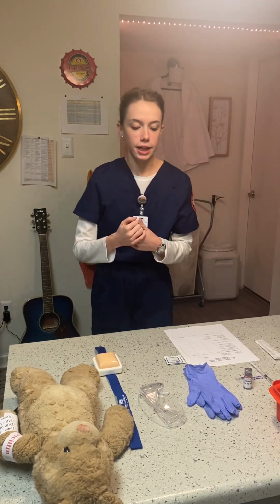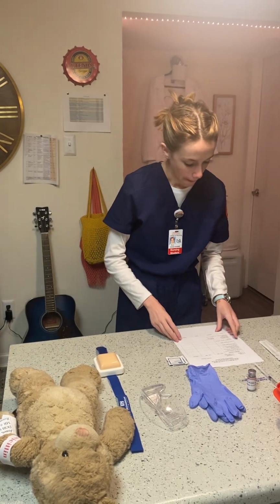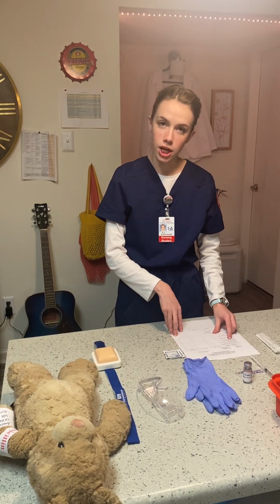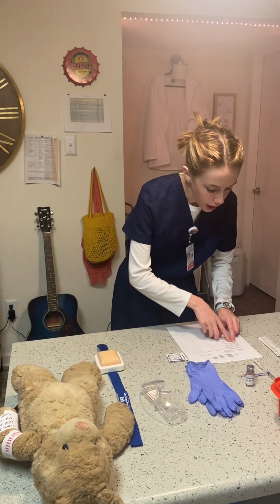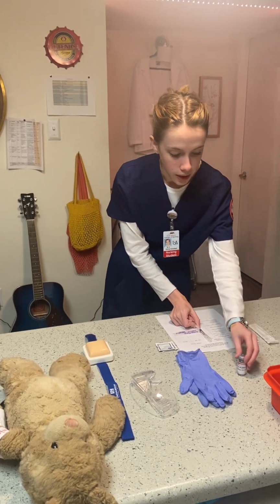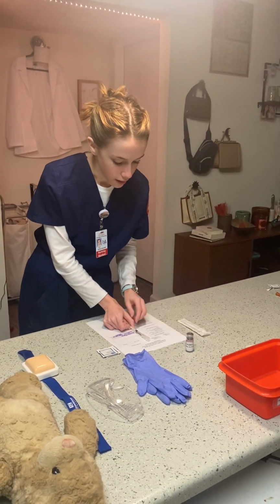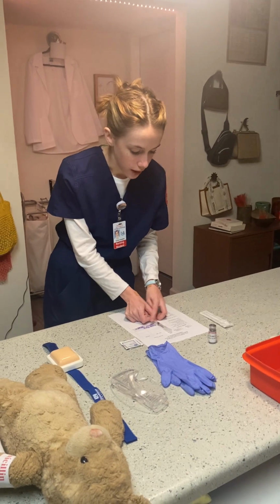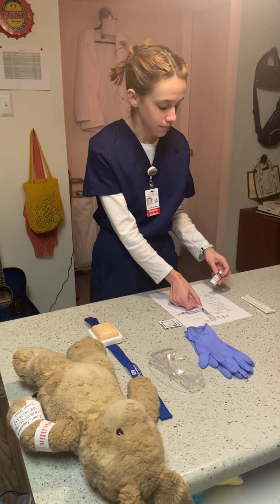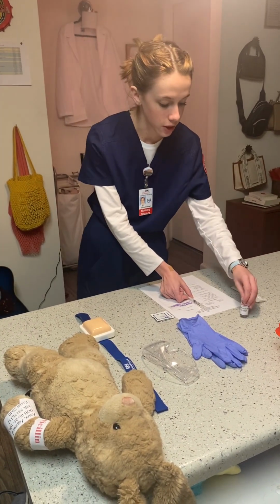go ahead and explain the rest of the 7 rights. So I'm going to verify that the medication for this patient is heparin. We've got heparin right here on the MAR, heparin on our label, and our heparin vial right here. We have got 5,000 units. And as we previously explained with the vial, we calculated the dosage out to be 0.5 milliliters.